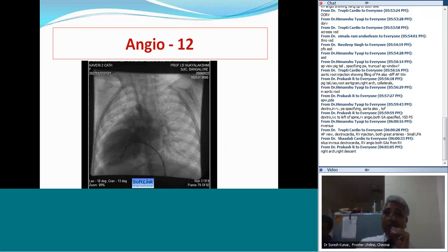You have the right atrium on the left side. The morphologic right atrium is on the left side because your venous catheter is going through the anatomic right atrium, which is located to the left. So you have an AV discordance. With that AV discordance, you have reached the smooth walled ventricle.